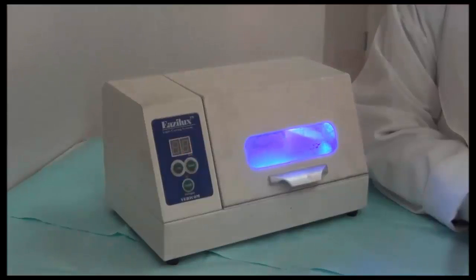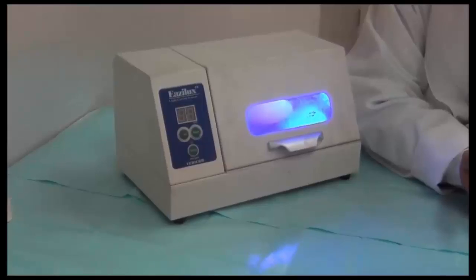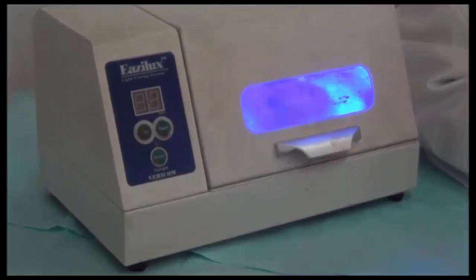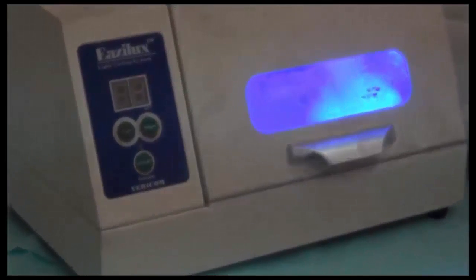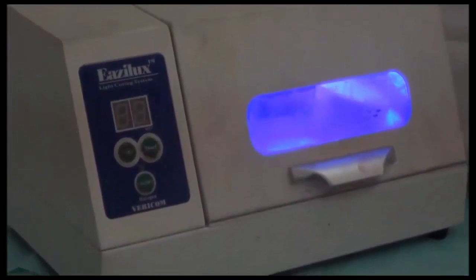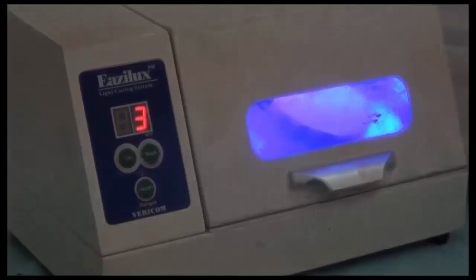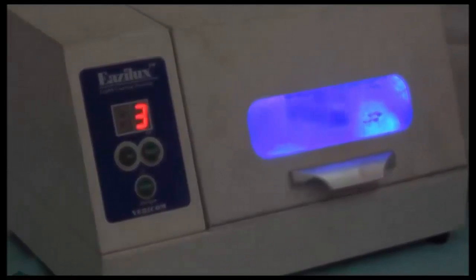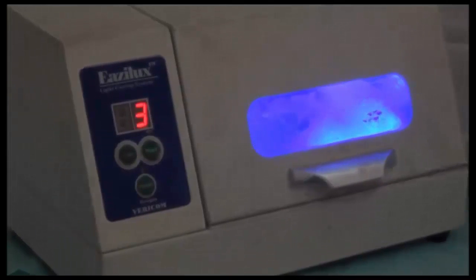This will expose more parts of the tray to the light all around. But even with this rotation, sometimes parts of the tray do not become solid. So after the first light curing cycle, we need to take out the tray from the cast and expose the fitting surface of the tray to the light as well.